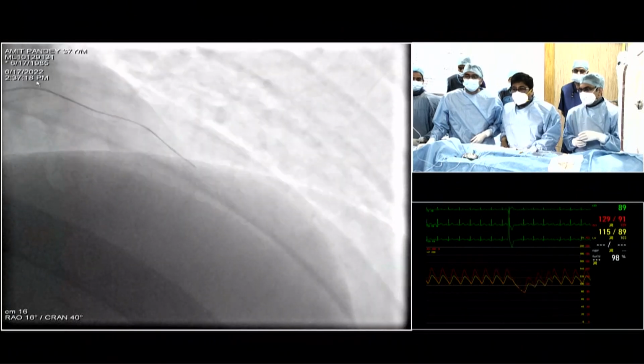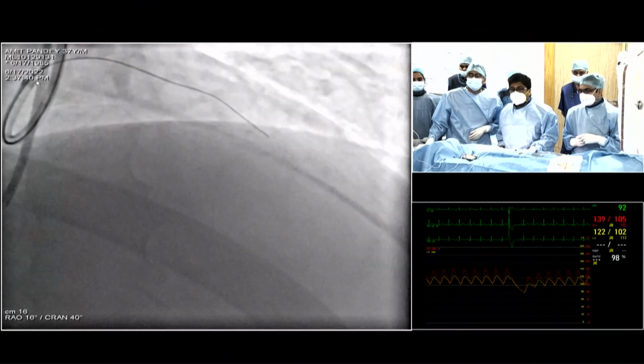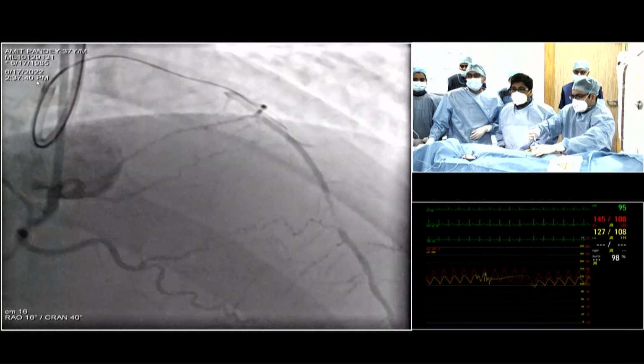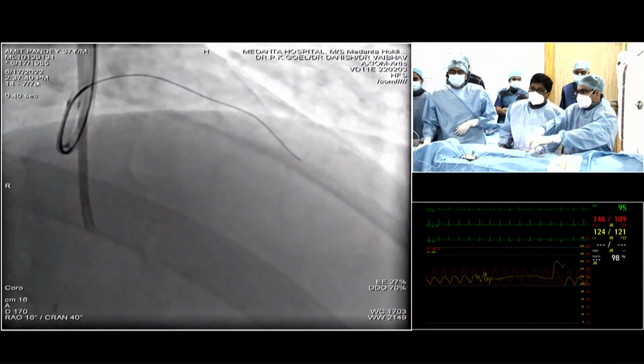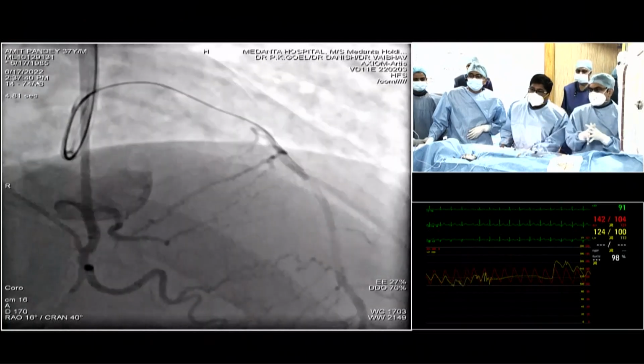Oh no, I don't know whether I'm correct. Ectopics are there. I'm not too sure whether I'm correct. So you might not be in a great place. Come on, right injection, please. No, I don't think it is correct. I think you keep the wire there.